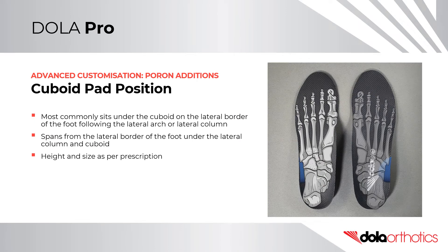Cuboid Pad Positioning. It most commonly sits under the cuboid on the lateral border of the foot, following the lateral arch or lateral column. It spans from the lateral border of the foot under the cuboid to the width of the lateral column. The height and size of the pad is as per practitioner preference and is often a result of treatment directed testing.